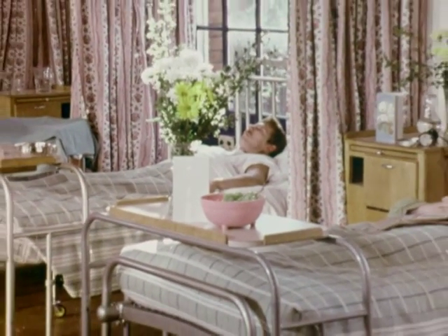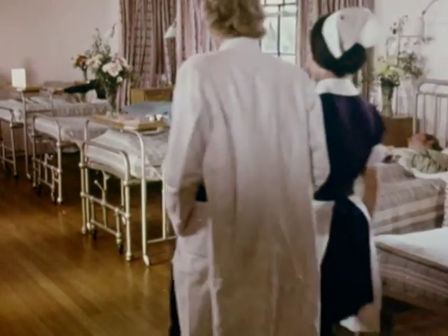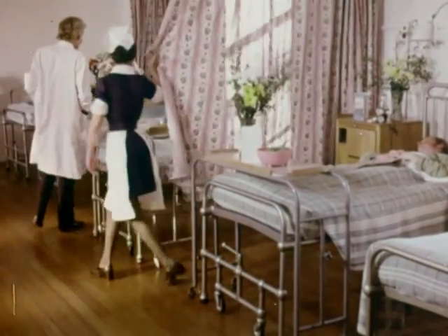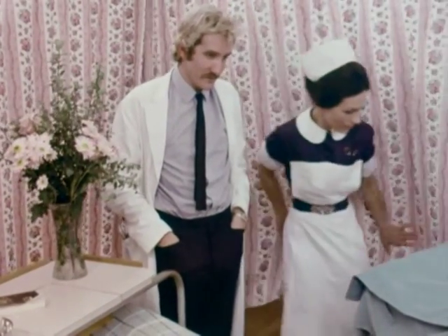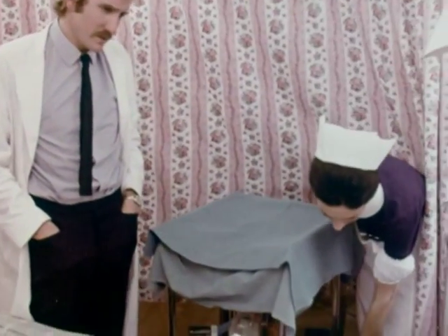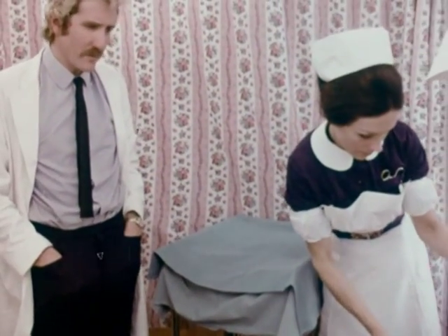Peter Williams, age 36. Gastric ulcer causing considerable internal bleeding. How is it, then? Not very well. Hello, Mr. Williams. Hello again. Now, remember I said you'd have to have a transfusion. It won't take long. Right, sister. Oh, by the way, is Mr. Williams left or right-handed? Left-handed. Good. Prepare the cuff, would you? Just going to put a cuff around your arm. Helps make the veins stand out, right?